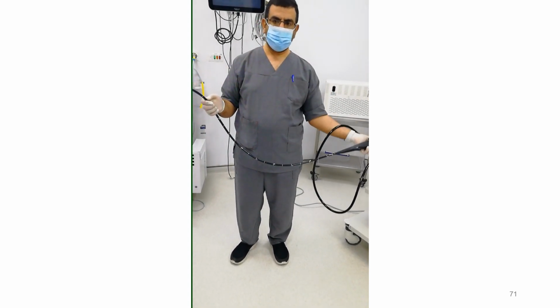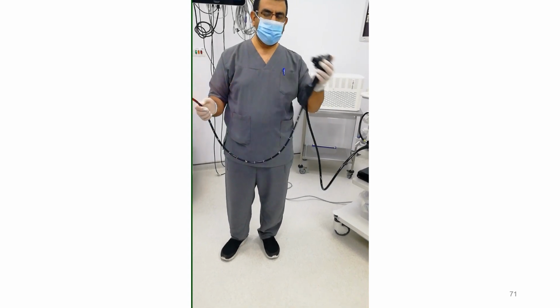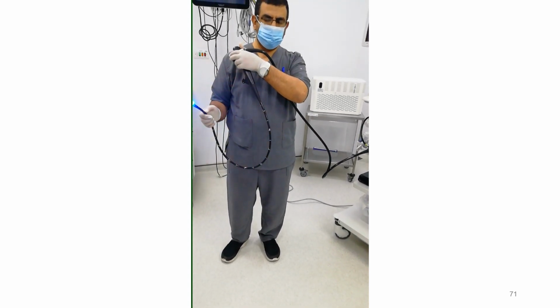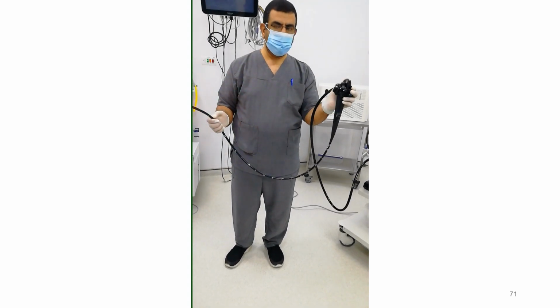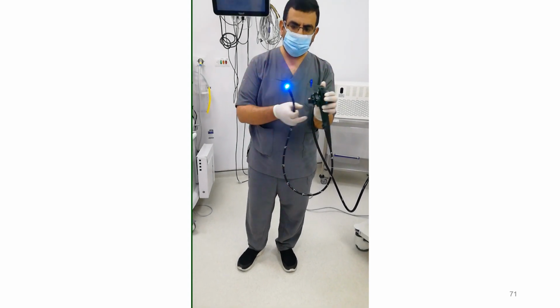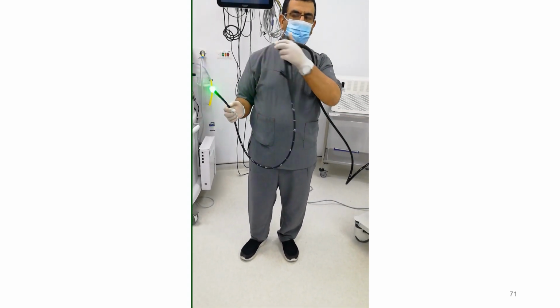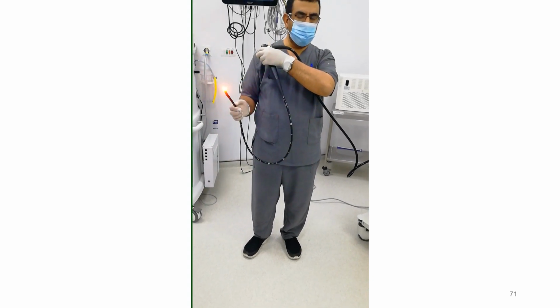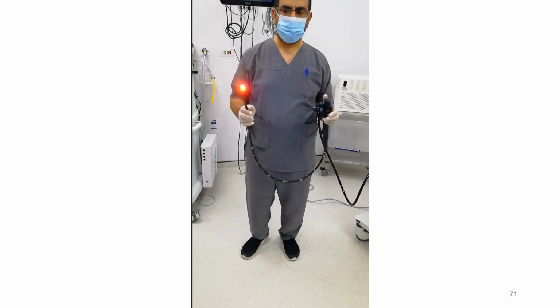إزاي؟ برمي دراعي شمال يبقى أنا إيد ليفت، لو أنا رميت دراعي لتحت يبقى أنا بجيب ليفت، لو أنا جبت دراعي من أقصى الشمال لأقصى اليمين ناحية الرايت شولدر بتاعي كده أنا بجيب رايت. يبقى ممكن تجيب عن طريق الريست، تعتمد على الريست بس ده بيعبها بعد فترة. الحل التاني إن أنا برمي إيدي شمال، أو بجيب إيدي من أقصى الشمال لغاية الرايت شولدر. يبقى ده تاني نوع من الحركة.